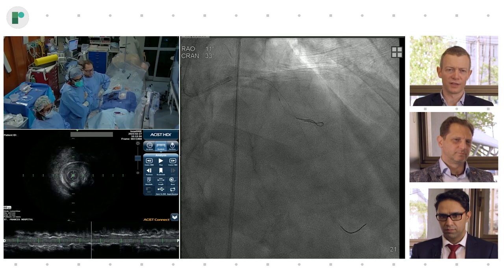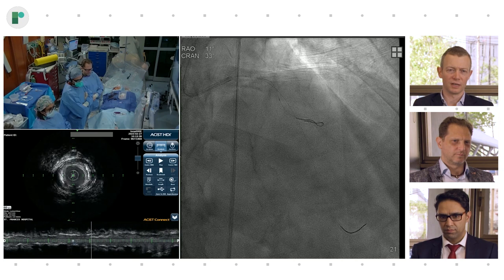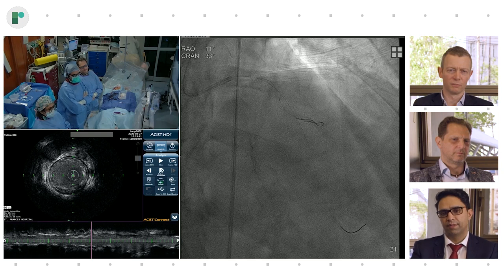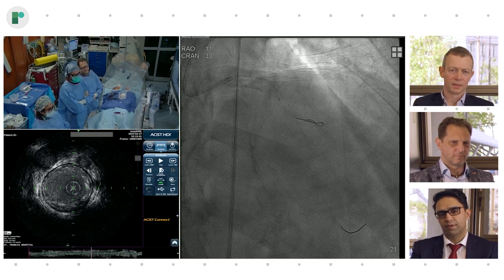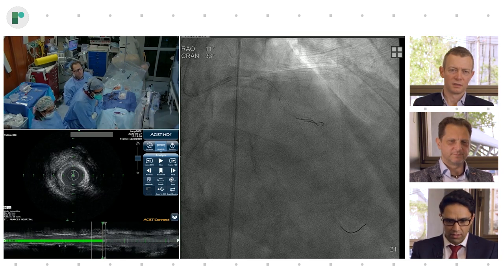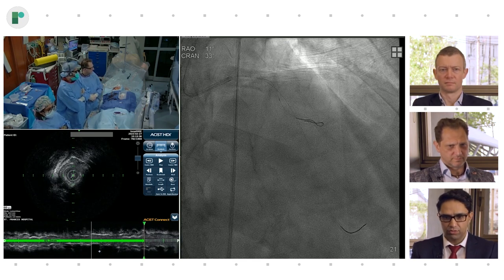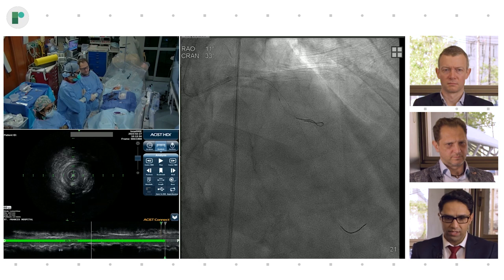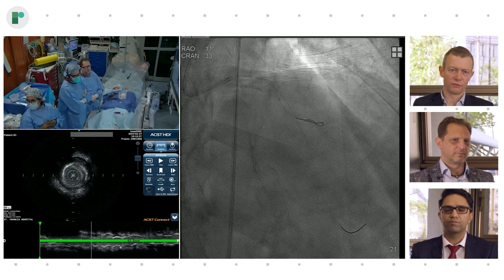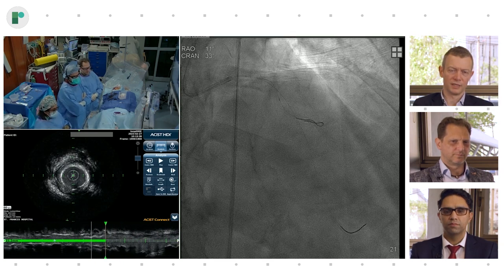Here, no severe calcification. You see a lot of disease. Some calcification here between 3 and 8 o'clock, but you see the vessel border throughout the vessel in most of the frames. And this is our proximal landing zone, so that's what we're doing now. Proximal looks a lot better. Absolutely. So here, what we're going to do is just measure from the distal reference to our proximal reference and do some math and basically see if we can fit this with one stent or two stents. Yeah. You see a lot of superficial calcium, as well, less than 180 degrees.